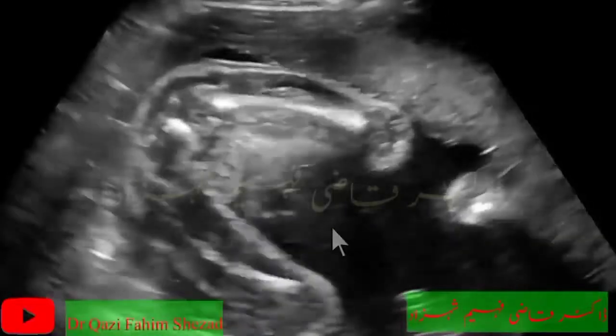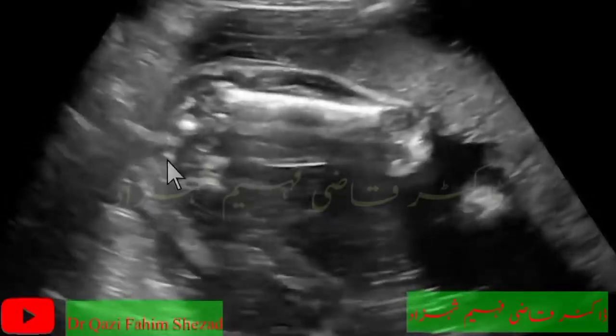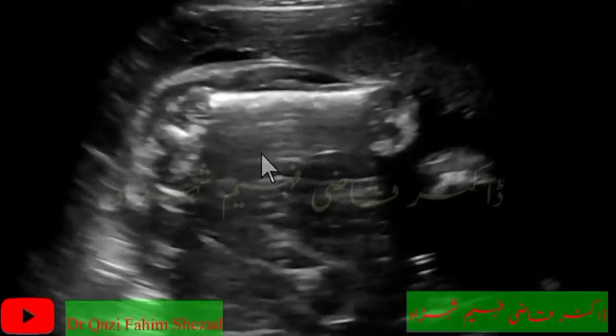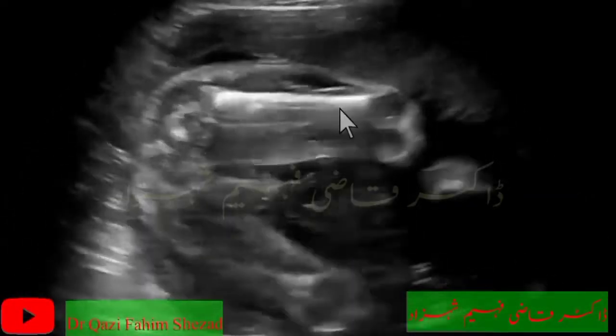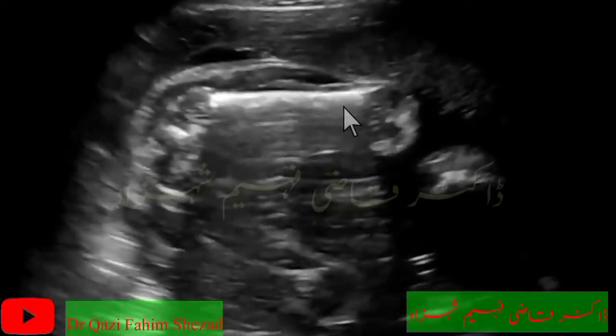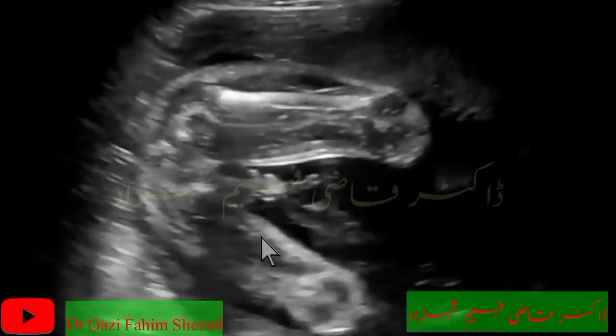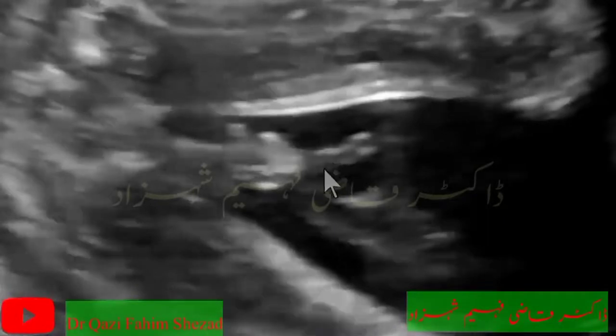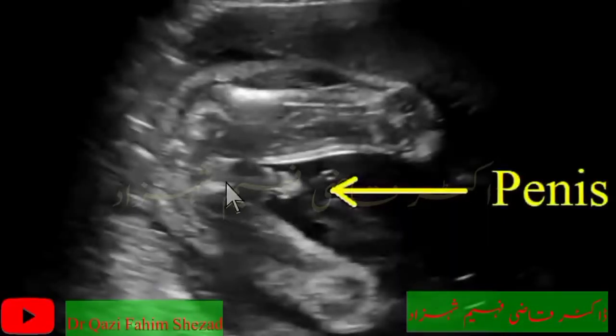The scanning is very difficult because the fetus moves regularly. This is the buttock region and this is the femur. And here you can see the genitalia of this fetus — beautiful genitalia.